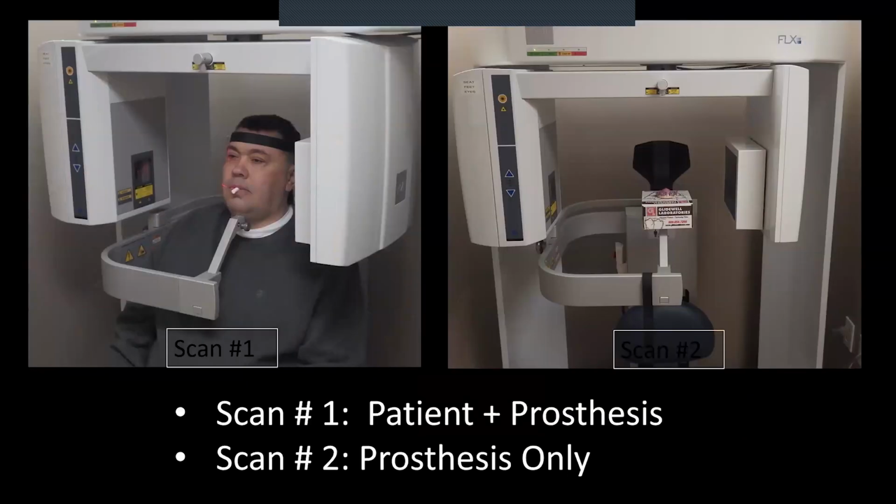So just to go over that again, the first scan is going to be the patient wearing the prosthesis with those radiopaque stickers, and the second or third scan is going to be of the prosthesis. The third scan would be if you're doing an upper and lower.